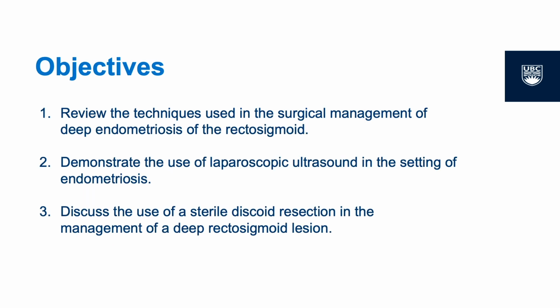Our objectives are to: 1. Review the techniques used in the surgical management of deep endometriosis of the rectosigmoid. 2. Demonstrate the use of laparoscopic ultrasound in the setting of endometriosis. And 3. Discuss the use of a sterile discoid resection for the management of a deep rectosigmoid lesion.